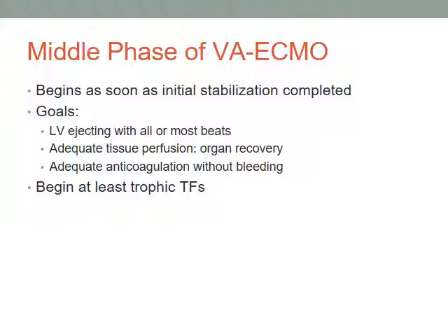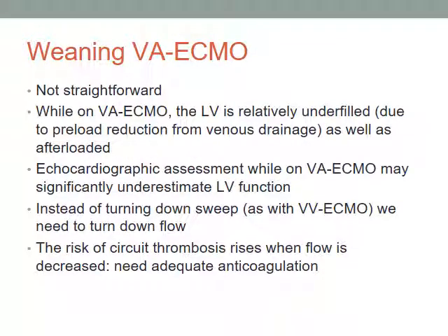Weaning VA ECMO is much harder than weaning VV. VV is simple. VA is hard. While on VA ECMO, the LV tends to be underfilled because you're draining huge amounts of blood from the patient from the right side. That blood doesn't go and fill up the LV. So you've got an LV that is sick, but it's underfilled, and it's never going to have a good ejection fraction until it gets some blood in it. So often echocardiographic assessment looks worse than it really is. You say, oh, that heart's not really beating very well, it's not squeezing well. Yeah, but it's also underfilled. So it may not be as bad as it looks.